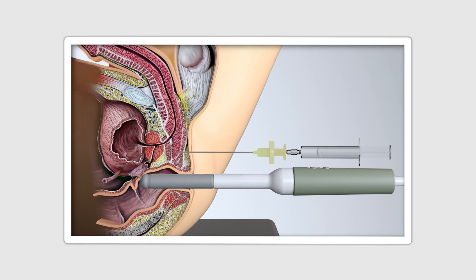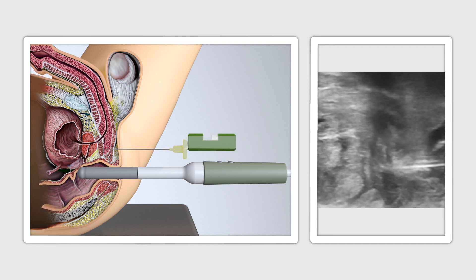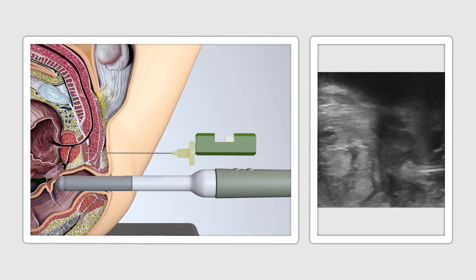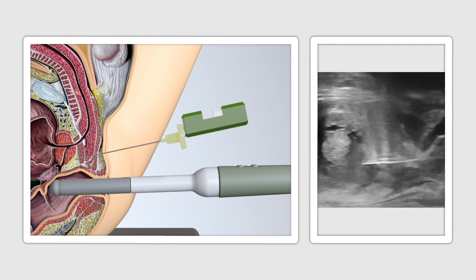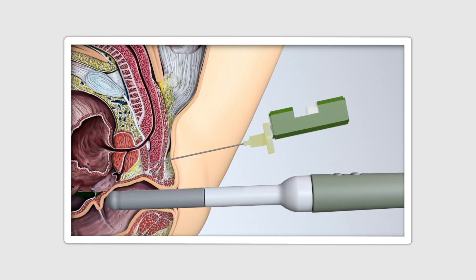Once the cannula is placed just adjacent to the apex of the prostate, some further local anaesthesia is inserted at the apical junction. Once deployed, the syringe and inner delivery needle is removed, leaving the cannulation probe ready for prostate biopsies. A standard biopsy needle, 18 gauge, is inserted through the cannulation device with no need for any extra insertion points. Under ultrasound guidance, the cannula is then directed to different areas of the prostate for samples to be taken, visualising the end of the needle and the direction of travel through manipulation of both the linear ultrasound probe and the biopsy cannula.